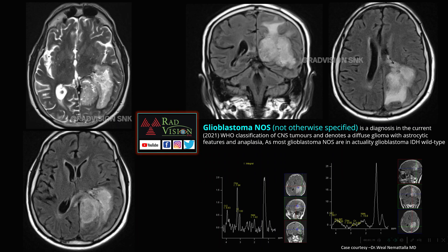Here there is a hyperintense lesion in the periventricular location, infiltrating the atrium and occipital lobe lateral ventricle, hyperintense on FLAIR with adjacent perilesional edema, and elevated choline-creatinine. This is glioblastoma NOS — not otherwise specified — a recent diagnosis in the 2021 WHO classification of CNS tumors, denoting a diffuse glioma with astrocytic features and anaplasia. Most glioblastoma NOS are actually glioblastoma IDH wild-type.